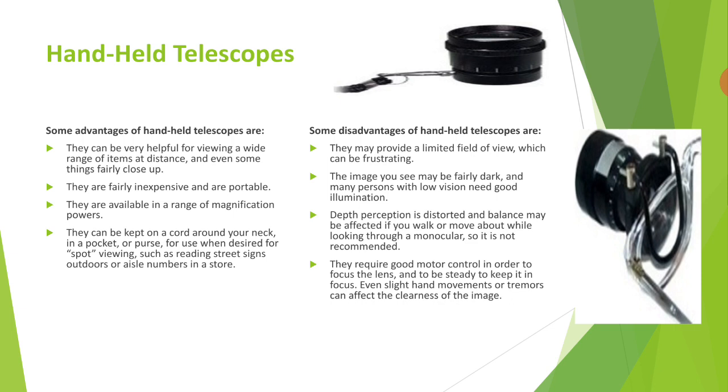Okay, the disadvantage of the handheld telescope is that it provides a limited field of view again, which can be frustrating.